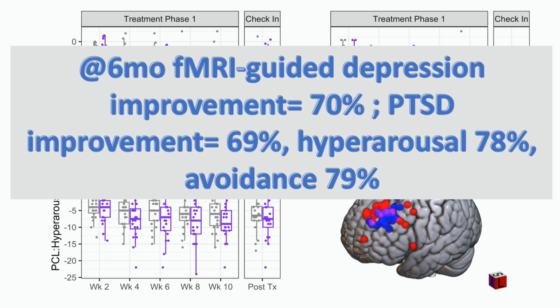So that level of improvement stands up to some of the best stuff that's out there that's been published, especially if you look at the 6-month mark. Not the immediate treatment, but we want the patients to endure with their clinical benefits, which is especially difficult to do. So no retreatment with TMS, one single trial, and these are the outcomes.